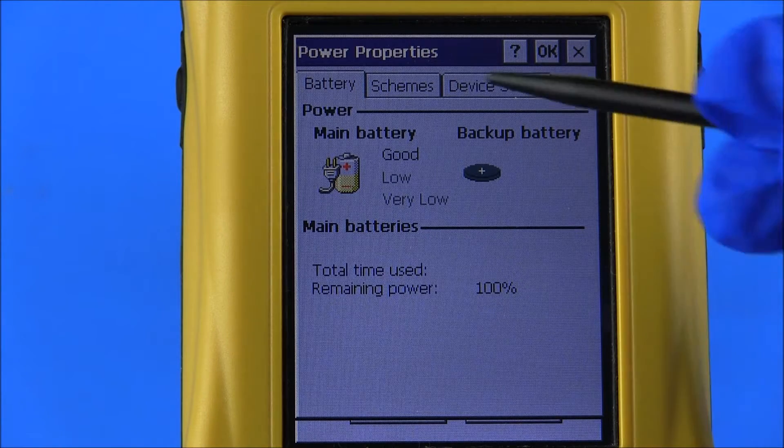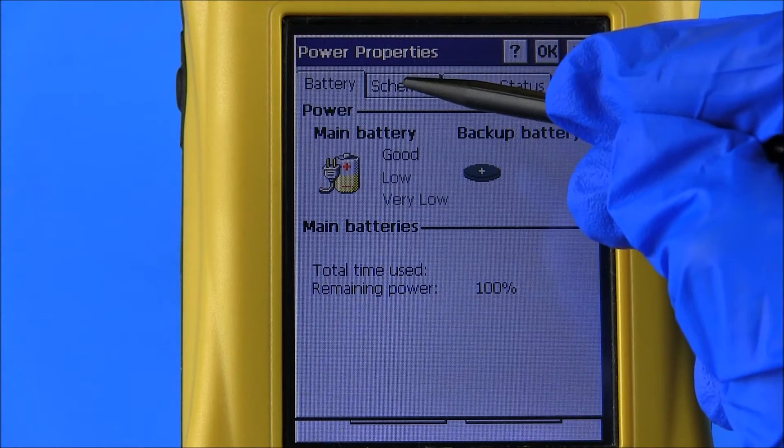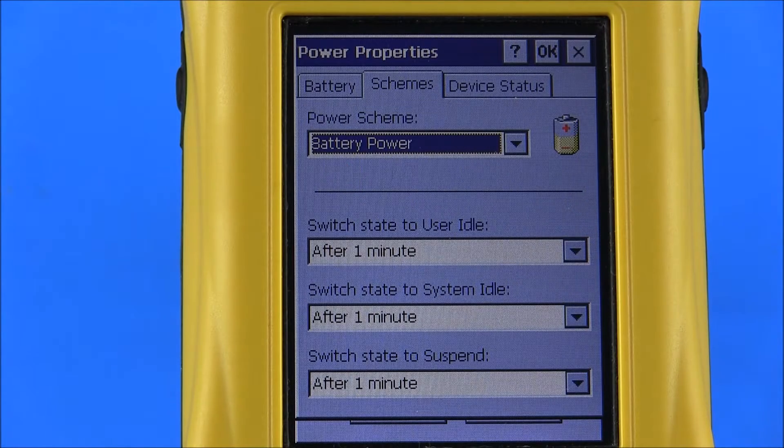Selecting the Schemes tab allows the user to determine whether the reader will run on AC power or battery power, and to change settings for time frames after which the reader switches to user idle, system idle, or suspends. The Program Reset will restart the operating system and will, in most cases, fix any issues which may occur. The Program Reset closes any open applications; it will not erase any saved data or saved settings.